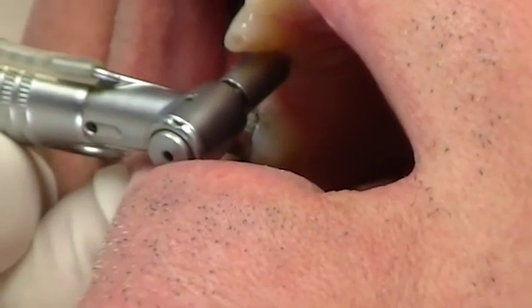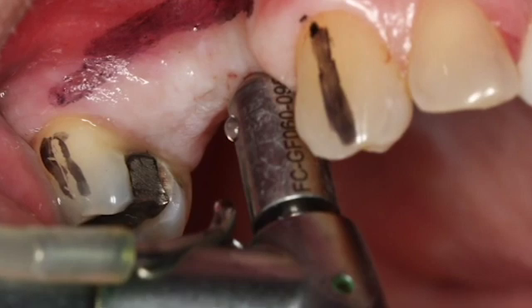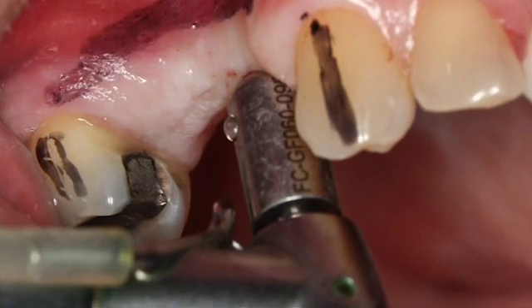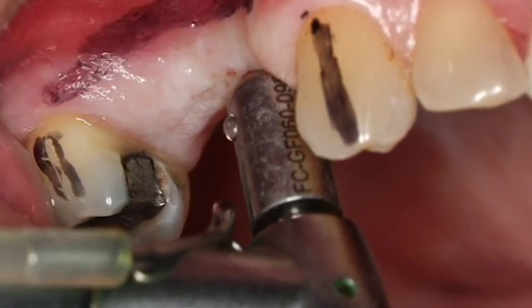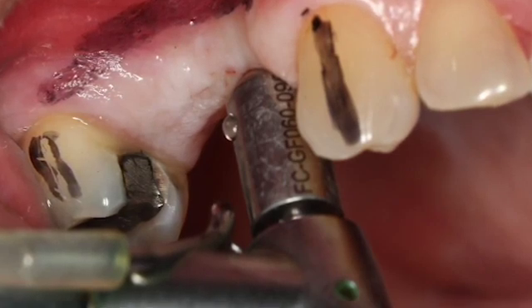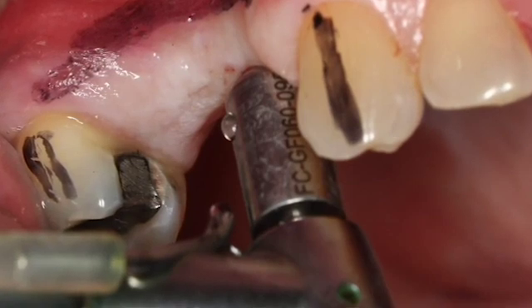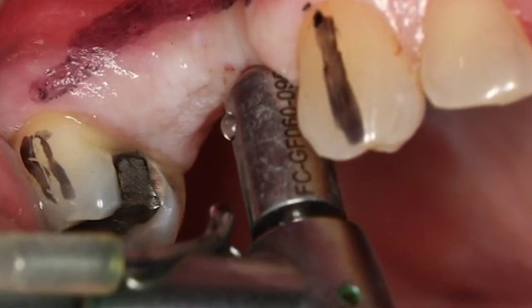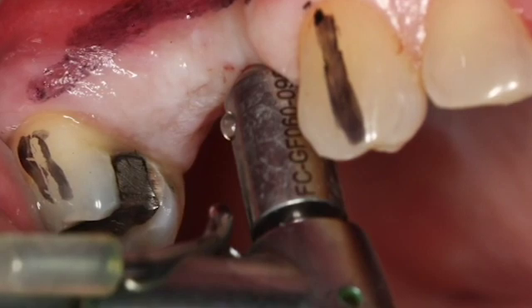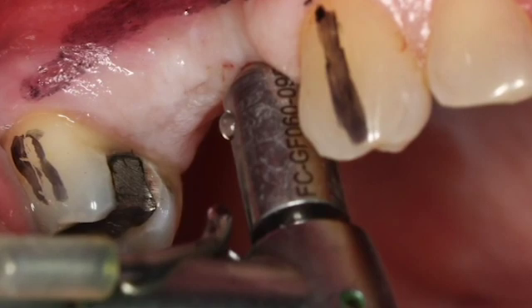It comes in a kit, and you can see it has a pilot drill at the end and a round cylinder which duplicates the mesial-distal width of the tooth you want to replace. One thing that's very important is being able to virtually place the implant before you ever touch the patient, and to imagine what the teeth are going to look like prior to surgical placement. I find this to be an excellent tool to help in determining proper placement.